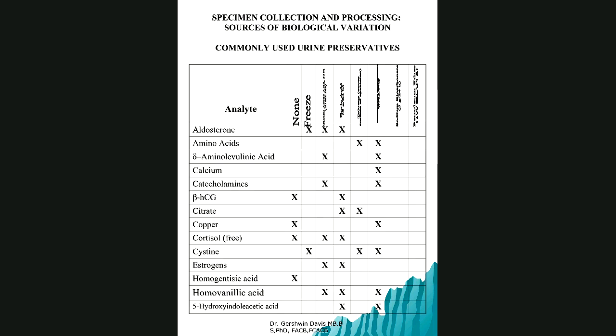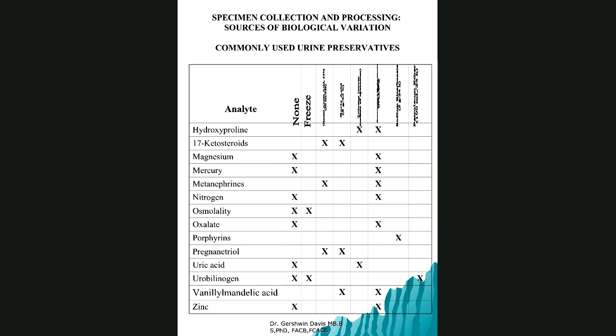In terms of a 24-hour urine collection, you would actually see the container. Remember, the container is not your Coca-Cola bottle, it's not your 2-liter bottle, which you might see sometimes because we're running out of bottles. But the container is actually a dark container to protect from light. And these 2 slides just remind me to tell you that the container comes empty. That's one: the 24-hour urine container is empty.